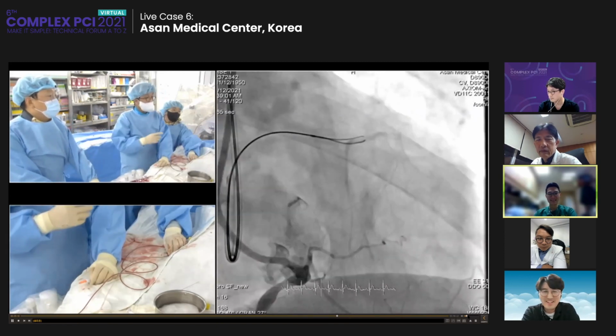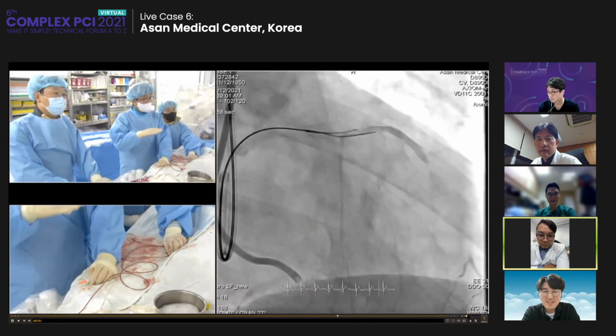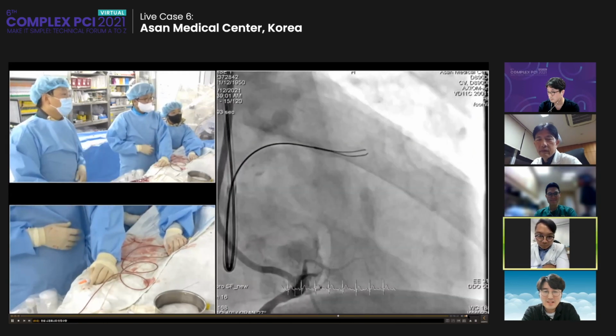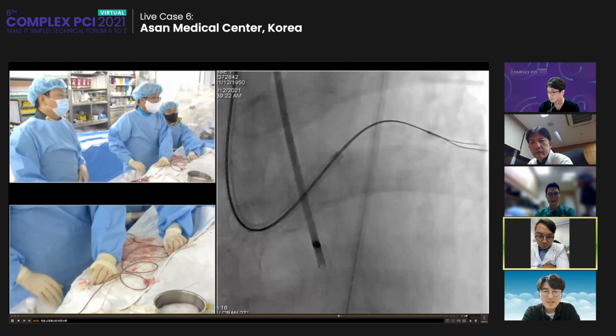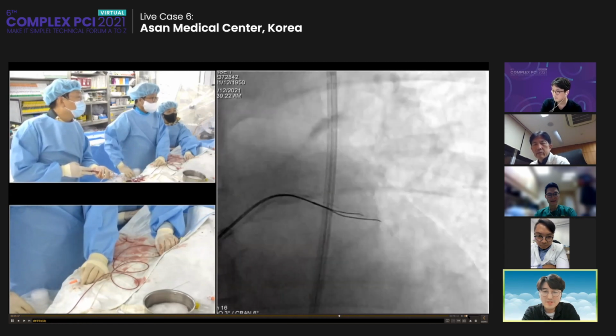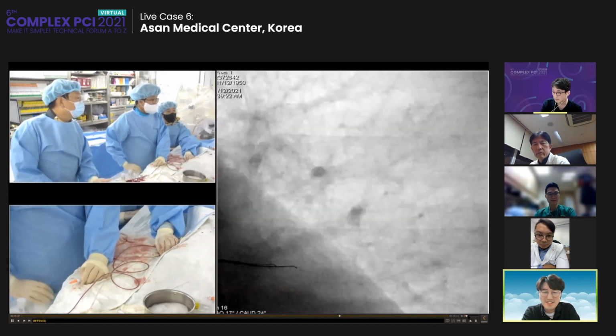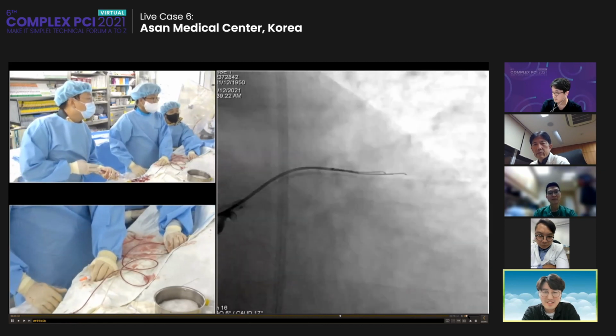The second wire should go to contact the inferior wall of the distal portion, and it is not that bad. But I still want to identify the exact position in another view. Because this is a Gaia Third, in this case maybe the caudal is not helpful because the wire is overlapped.